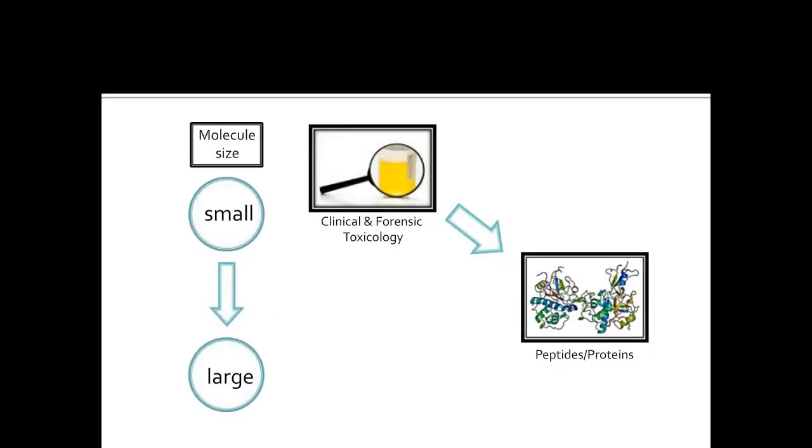Another area I wanted to discuss is the molecule size. Traditionally, mass spec on the clinical side has been used for small molecules. And now what we wanted to do is move to the large molecules. When we talk about large, mainly it's proteins, peptides, or lipids.